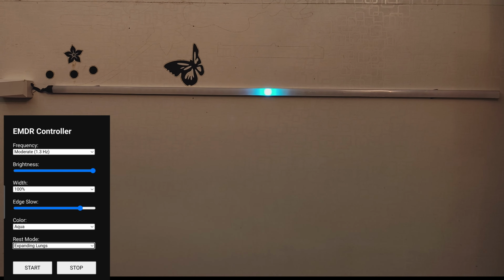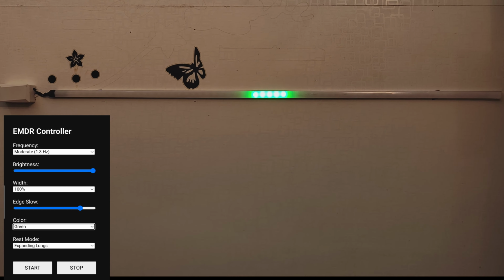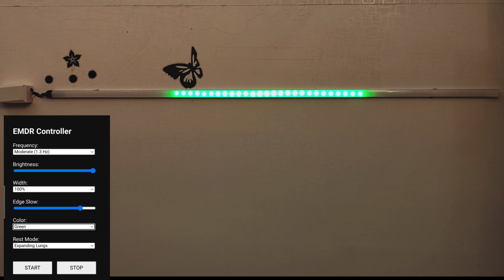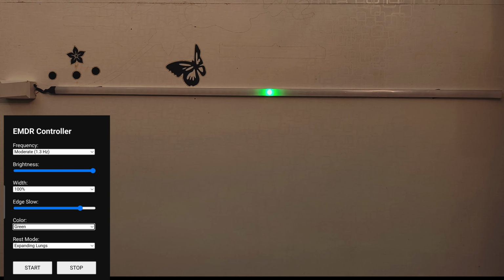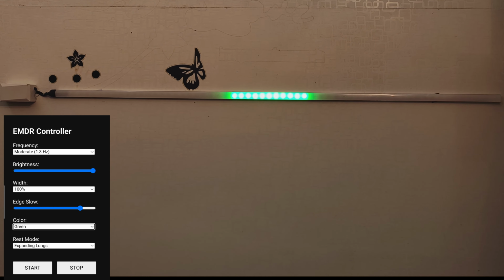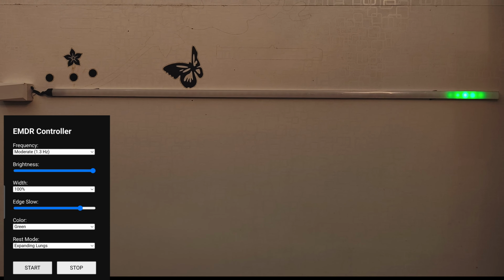Then I can also use this breathing mode. It simulates expanding and contracting lungs, and I can also change the color on the fly. The clients can easily breathe in and out with this. I can also choose to keep the lights off in between sessions if the clients feel overwhelmed and distracted. And when I press start again, the next session starts.